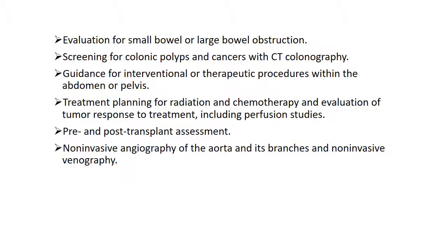Guidance for interventional or therapeutic procedures within the abdomen or pelvis. A lot of times we'll order CT guided biopsies of things. So if you see a liver mass that you would like to get a biopsy of and see what it is, you can do a CT guided biopsy of that mass. So under CT guidance, the radiologist is able to go in and actually take a sample of that mass and send it off to pathology.